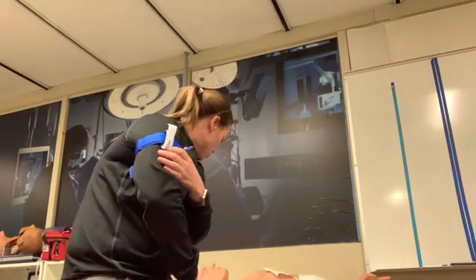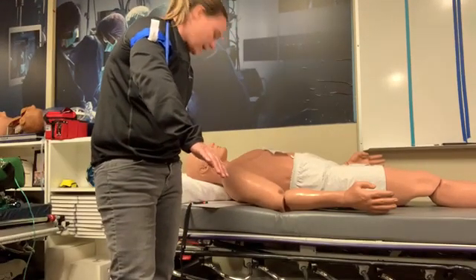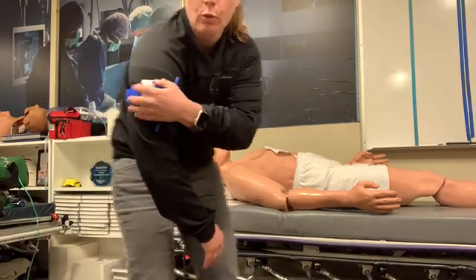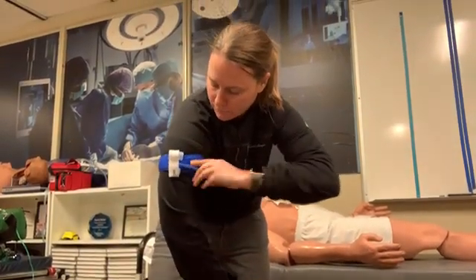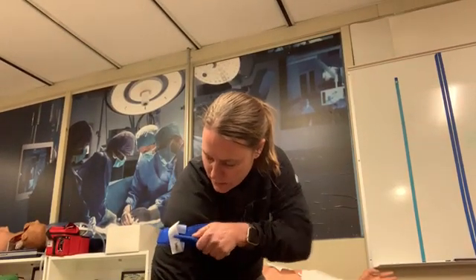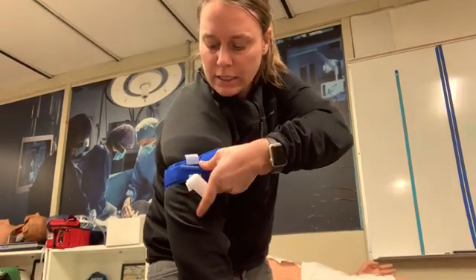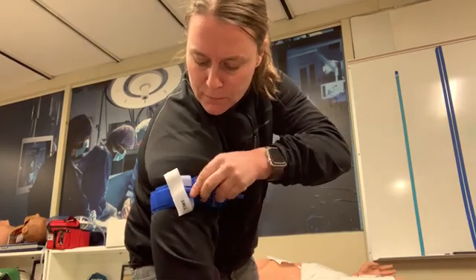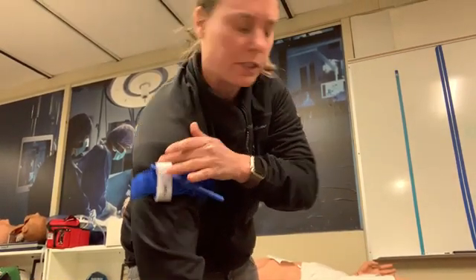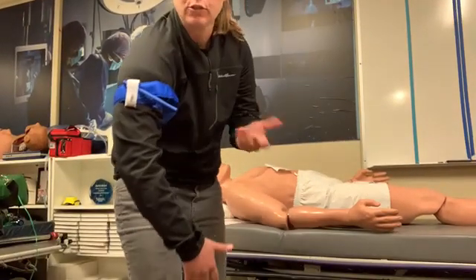Okay, and then it asks you to go ahead and talk to your patient, let them know that it's going to be tight, it's going to hurt a little bit, and you're going to twist this rod called the windlass. You're going to twist this rod as tight as you can get it. Okay, and again, you shouldn't have to spin this very many times for it to go, and then it's going to lock in place inside there, like that. And then this will go over the top and help secure it on there. And that's what they have you do on the rubric.